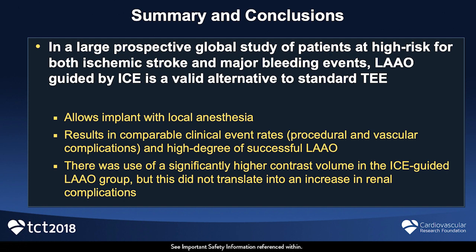Allows implant with local anesthesia, results in comparable clinical event rates, and there was significantly higher contrast volume as expected. So what to expect, not dissimilar from AF ablation.